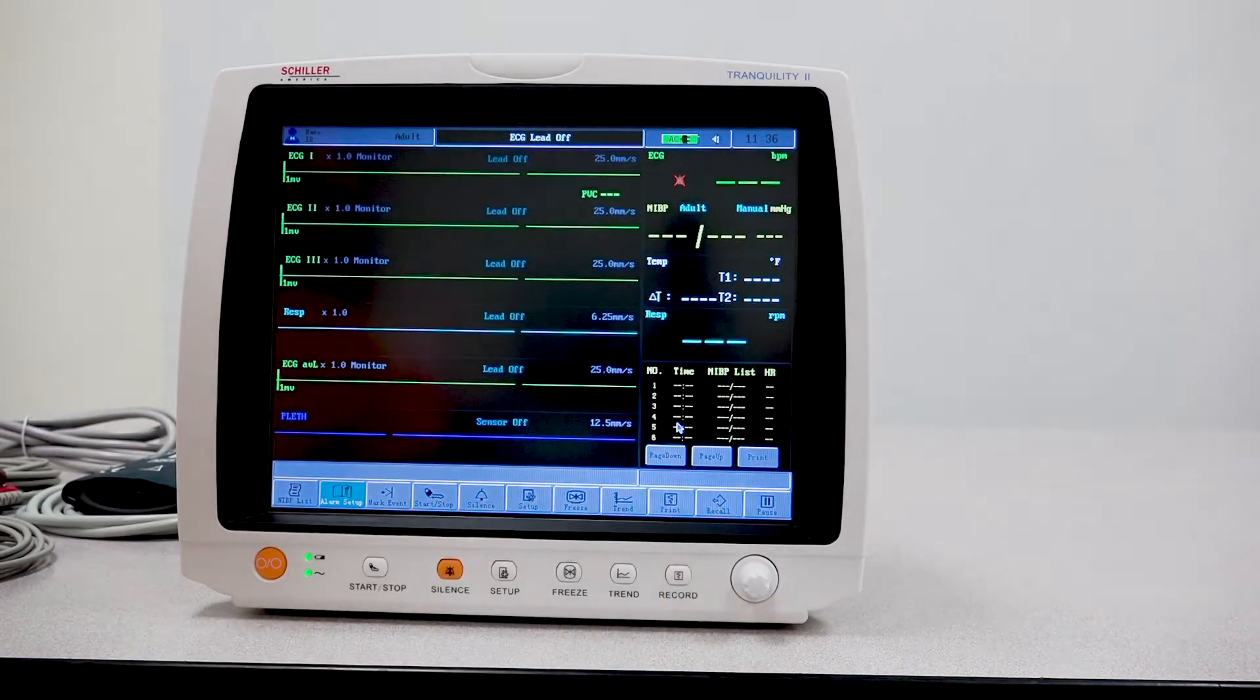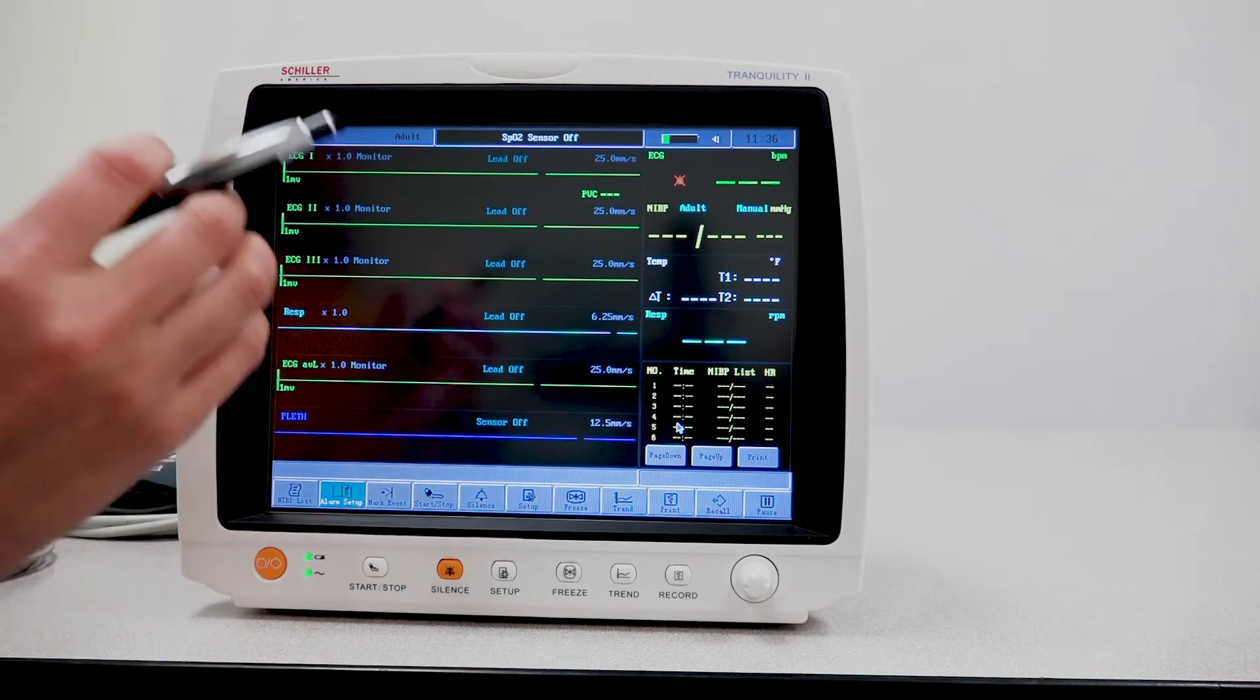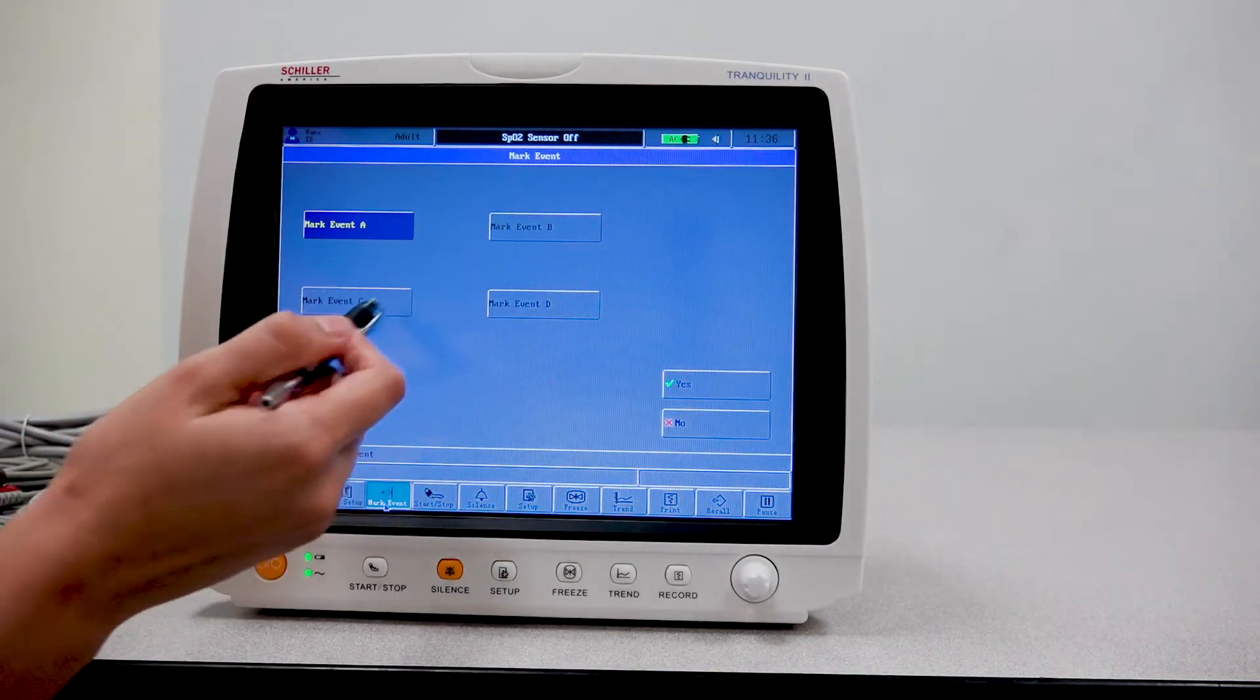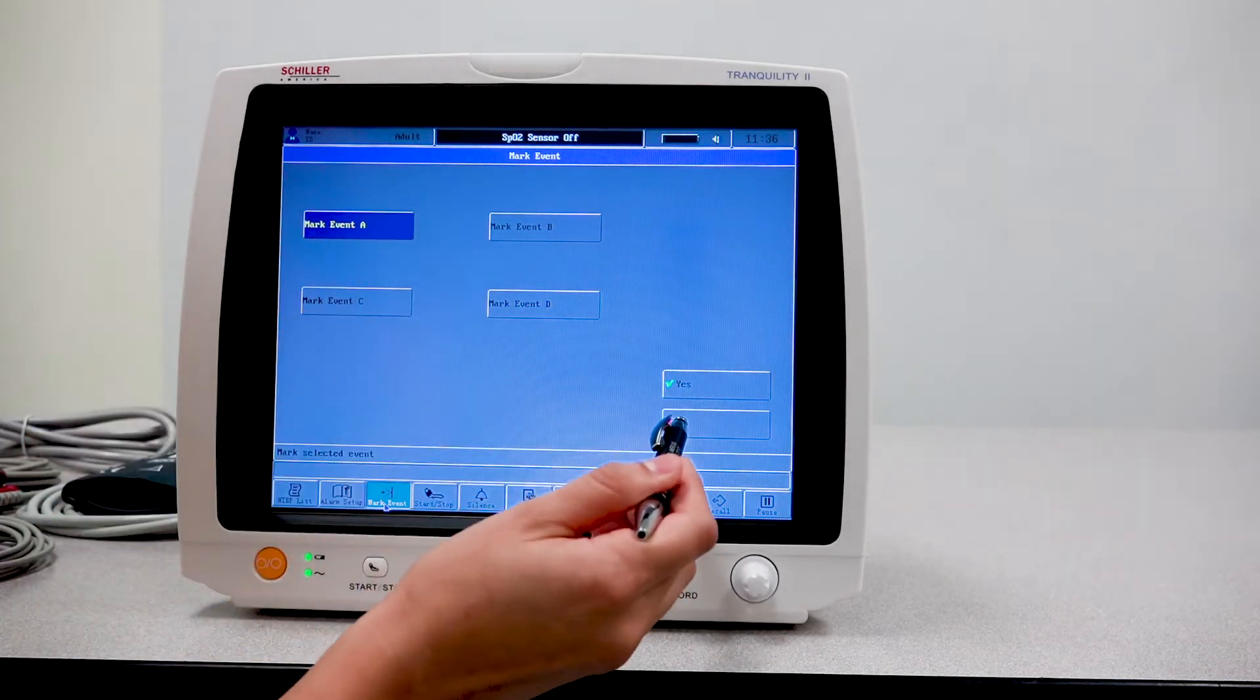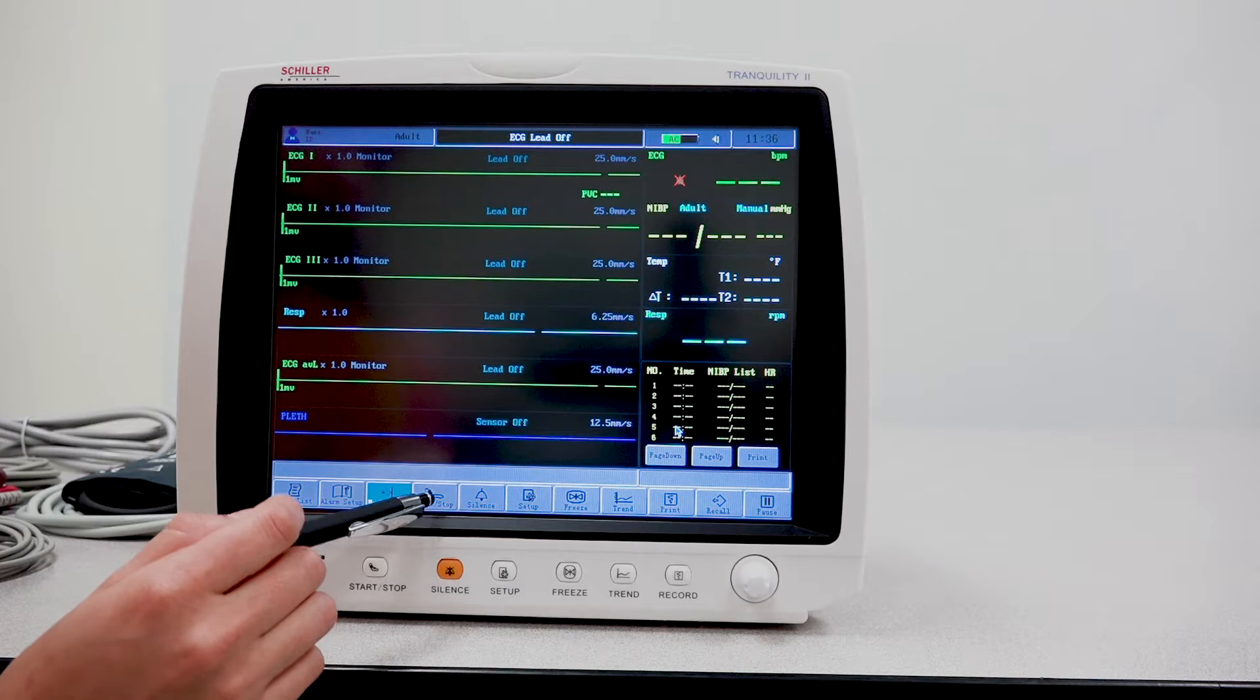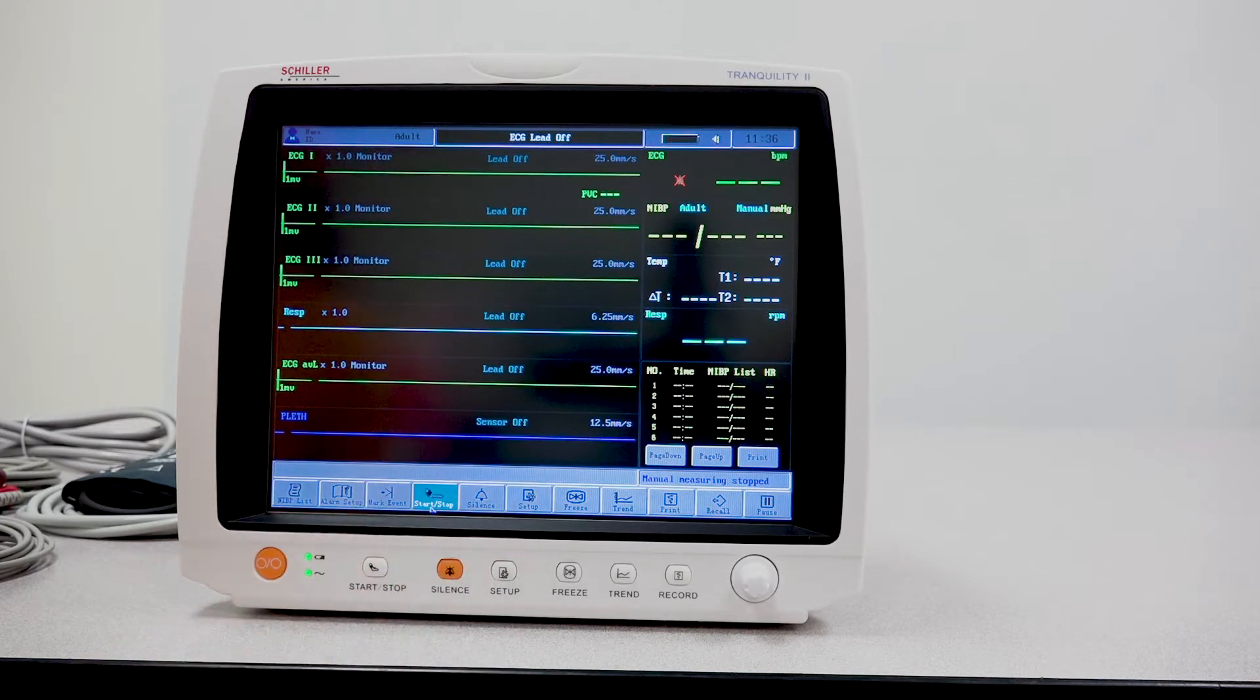You have the mark event tab here, which you will press at any moment that you feel that you want to record that event. You'll select whichever you choose to associate with that particular event. You also have the start stop button. This is particularly for NIBP to start an NIBP measurement or stop it manually.